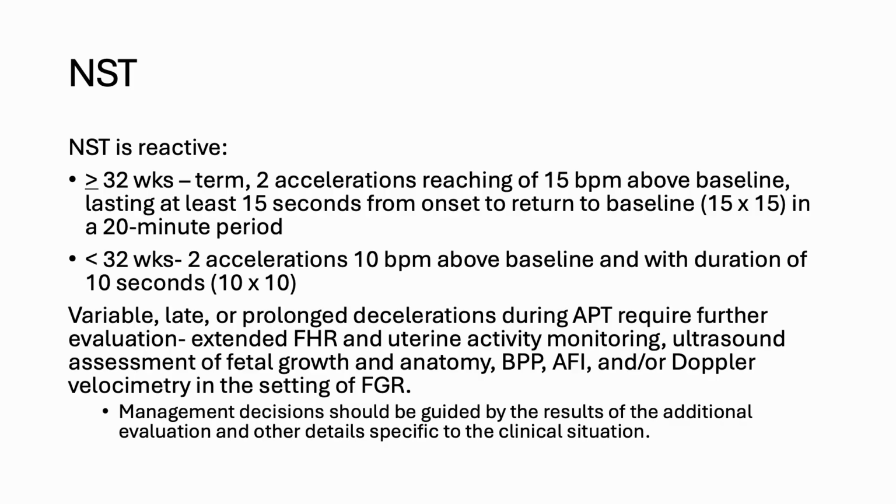So all of these you likely know, but a non-stress test is reactive when the gestation is greater than or equal to 32 weeks, and there are 2 accelerations with an increase of 15 beats per minute above baseline that lasts 15 seconds with a return to baseline.